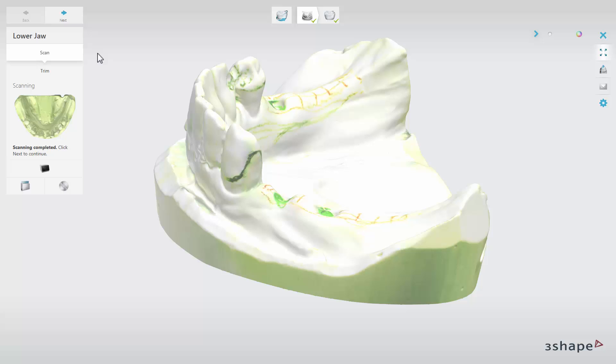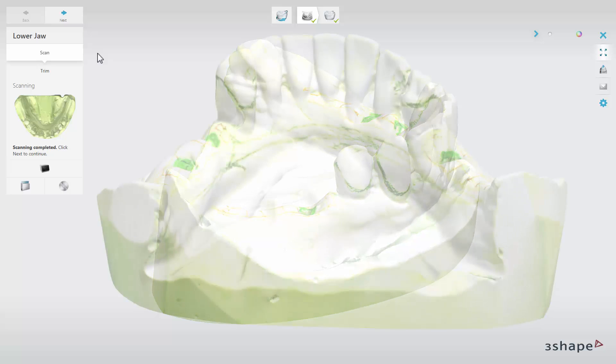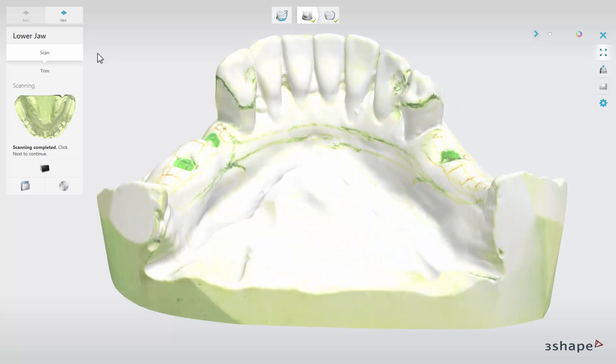Here are some examples of models after the previous procedure. You can use as many colours as you need to represent different parts of an RPD, like clasps, retention grids, and others.